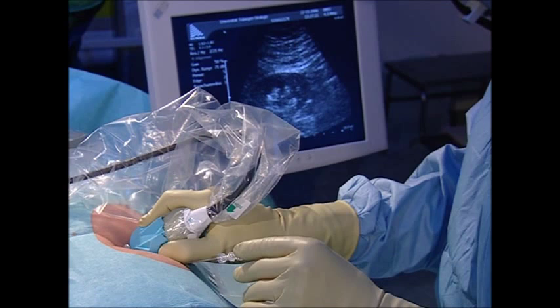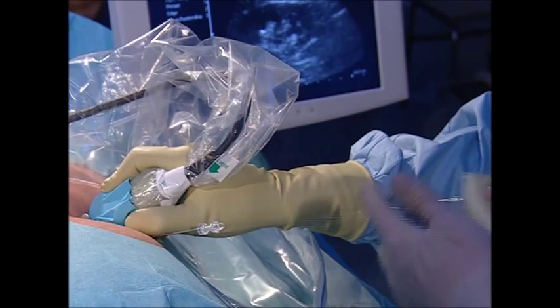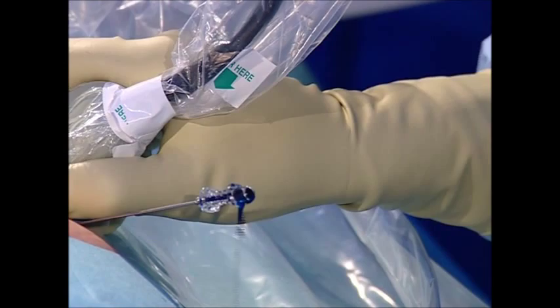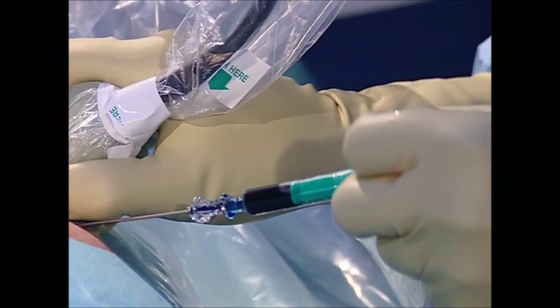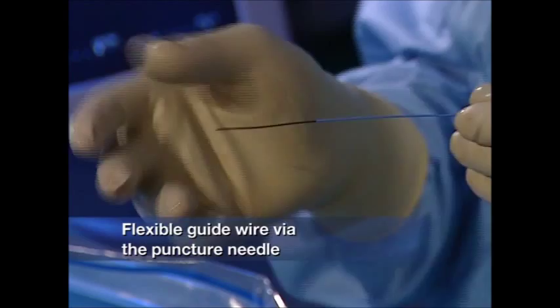X-ray monitoring in the second plane helps to confirm the exact location of the needle tip. Once the stylet is removed, blue-dyed contrast medium flows out of the needle, and urine is collected for microbiological examination. A flexible guide wire with a hydrophilic tip is introduced into the renal collecting system via the puncture needle and positioned in the superior calyceal group or in the ureter. The flexible tip prevents perforation of the renal parenchyma.